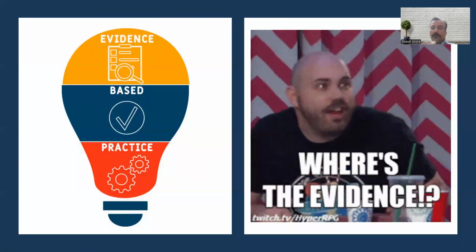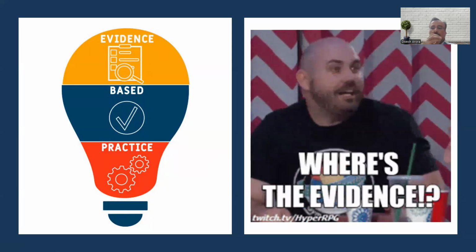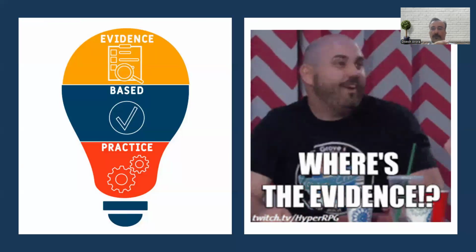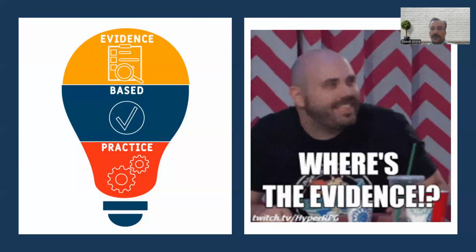Now, my dear friends, I have discussed the qualitative as well as quantitative assessment of left ventricular ejection. The next question that comes to mind is, we are not cardiologists, we are perioperative physicians, that is anesthetists.